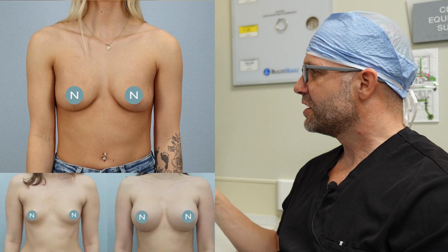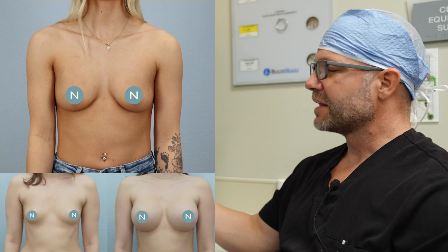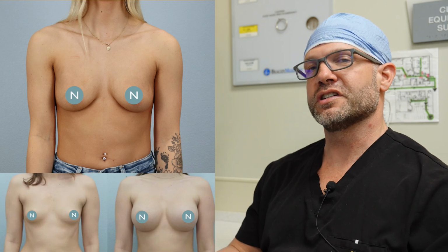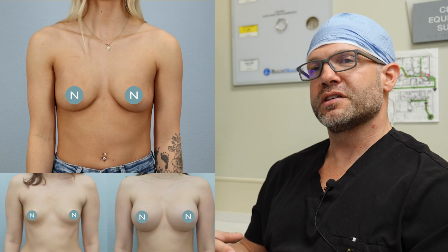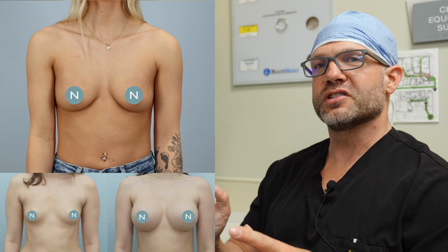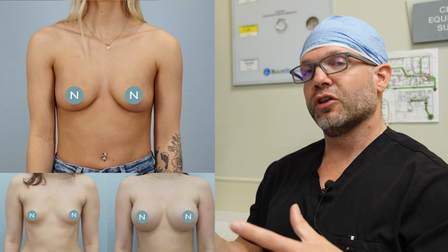So for example, in this patient, we look at the before picture, what they want, and from that, I usually will recommend a range of sizes, and they'll trial some sizers to see if those correlate. And then with that being said, what we do at the time of surgery is we go into the operating room, we make the pocket or entry, and then we put sizer or sample implants in, and essentially just look at the before and after pictures to determine how closely they're aligned.